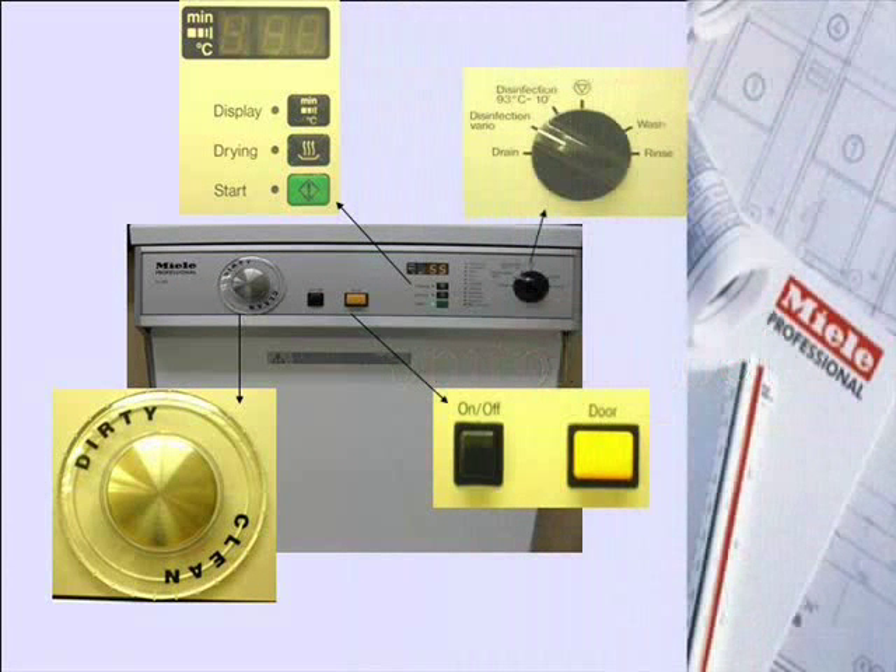Before starting the procedure, let's get familiar with the control panel of Model G7881 Millay Dental Thermal Disinfector that we use at Foothill College.